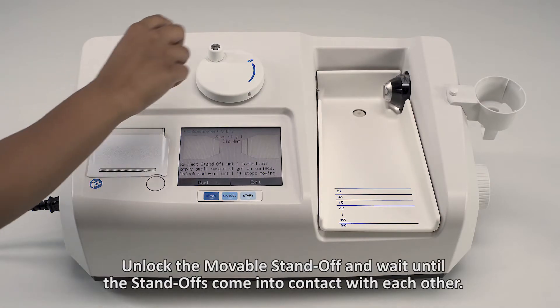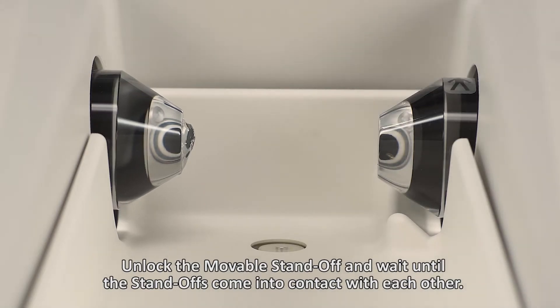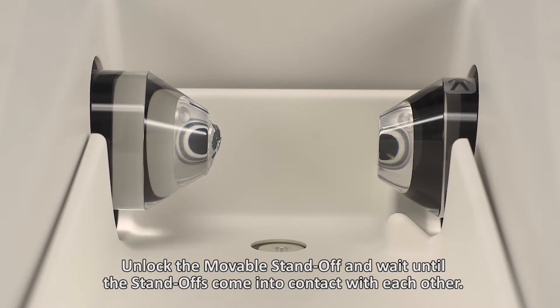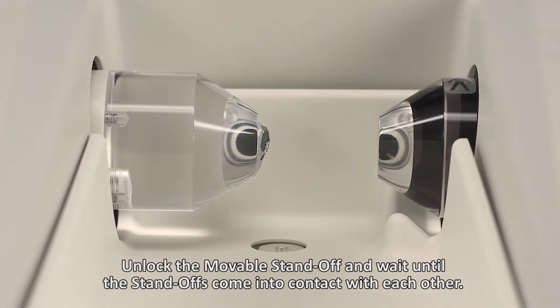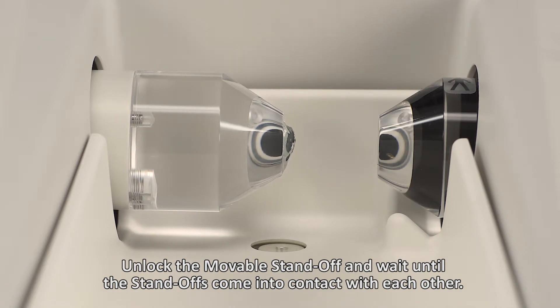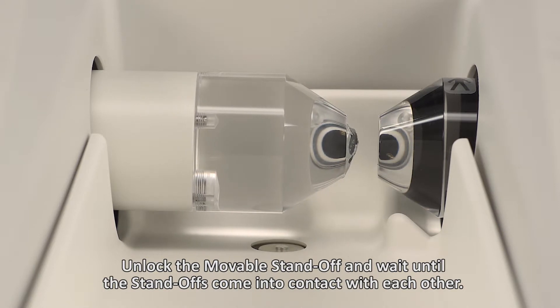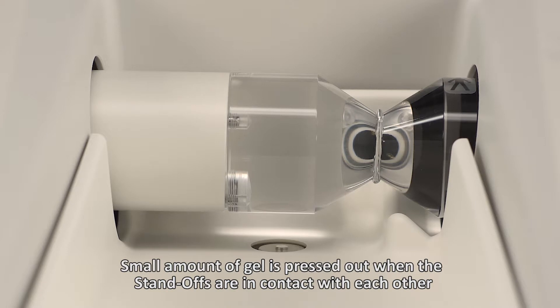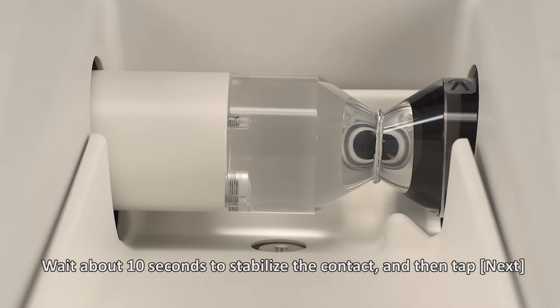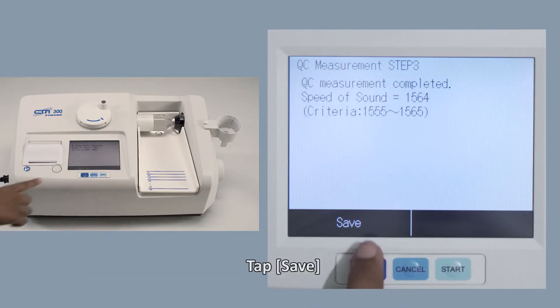Unlock the movable standoff and wait until the standoffs come into contact with each other. A small amount of gel should be pressed out when the standoffs are in contact. Wait about 10 seconds to stabilize the contact and then tap Next. Tap Save.